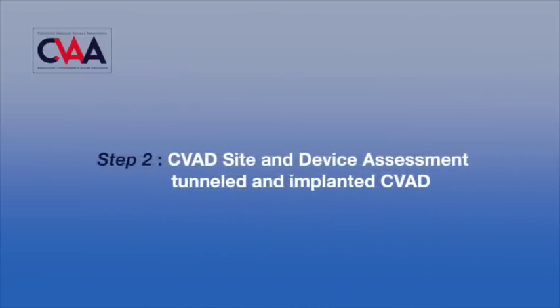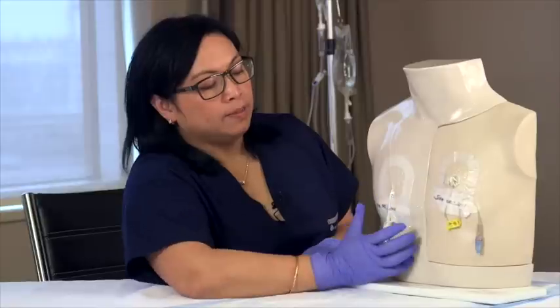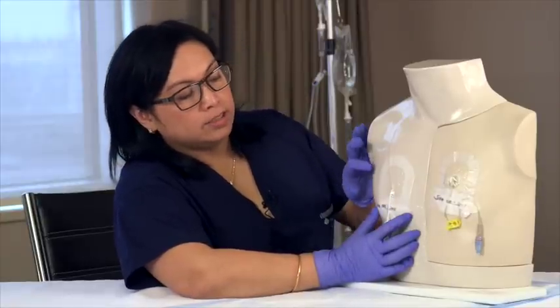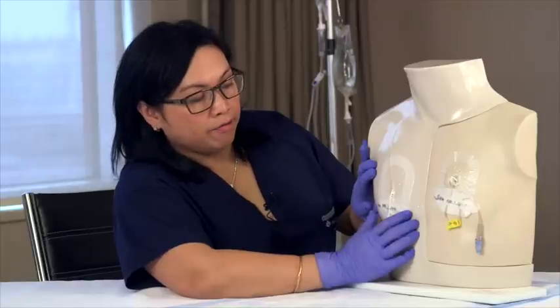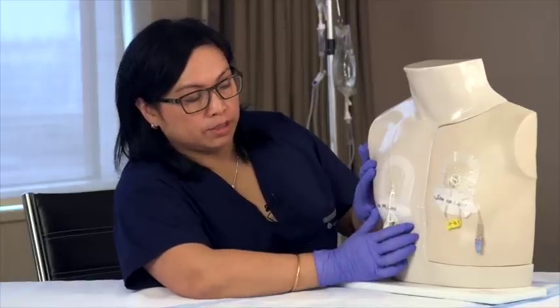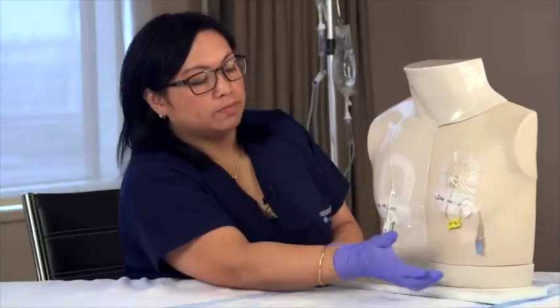Step 2. CVAD site and device assessment. Now we are going to go through the assessment of 2 different types of lines that are commonly found on the chest. One is the tunneled CVAD, the other is the implanted CVAD. The tunneled CVAD is typically secured with the internal cuff as well as the securement dressing. The implanted port always has to have a non-coring needle accessed, and that becomes part of our assessment.